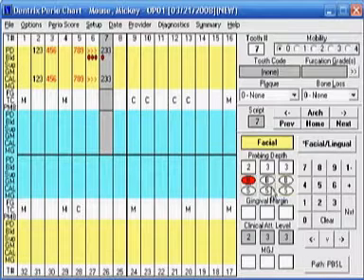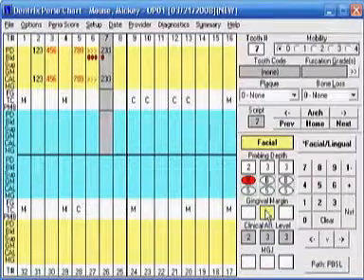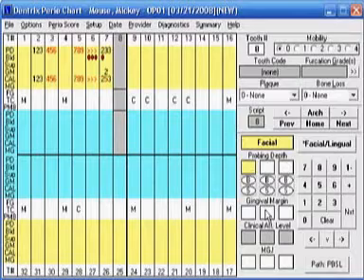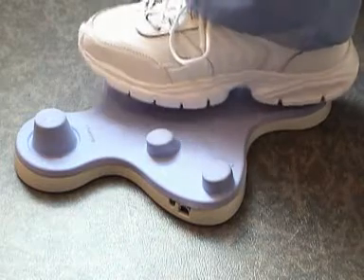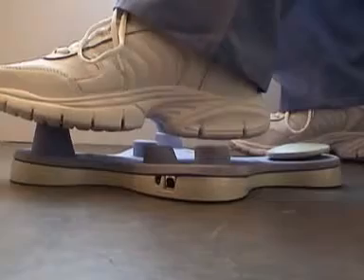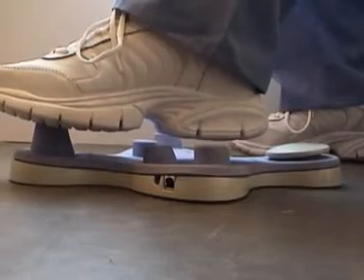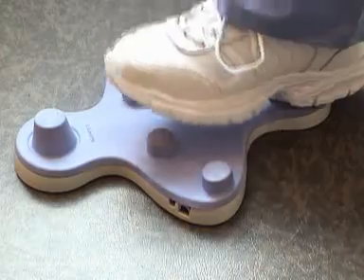Now if you have recession, just take your mouse down to gingival margin, rock back, and enter the millimeters of recession. For example, on tooth number eight you have a 4-3-4 with two millimeters of recession and bleeding in the buccal. So you go 4-3-4, then highlight the bleeding by putting the mouse on the bleeding icon, and then enter the two millimeters of recession by taking the mouse down to the gingival margin area and entering the two.